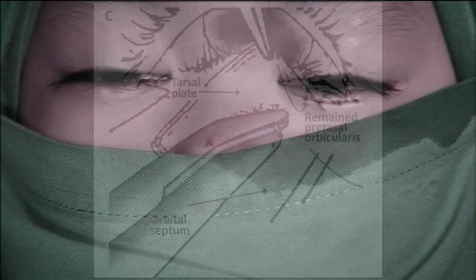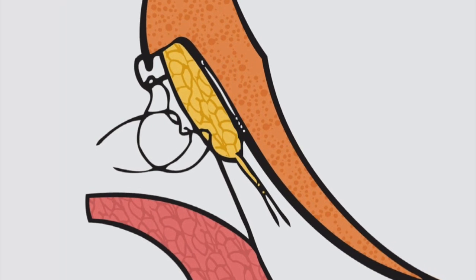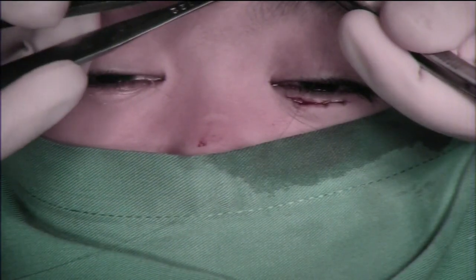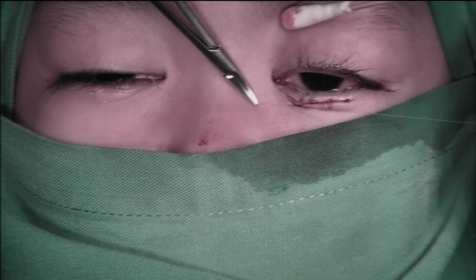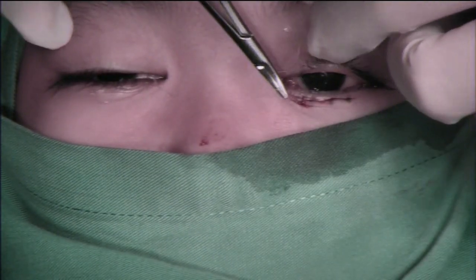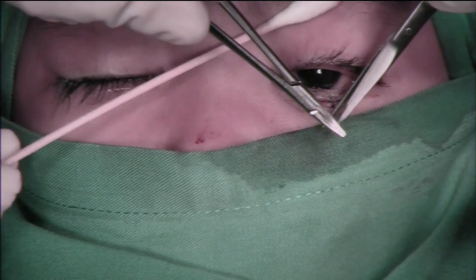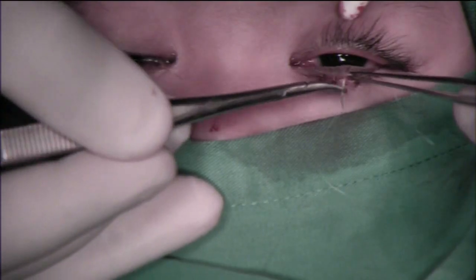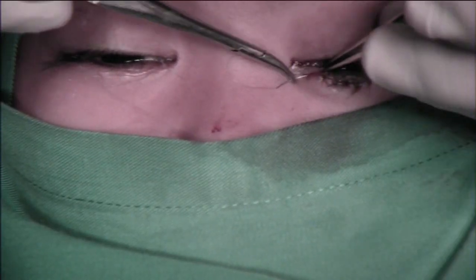Next, suture the skin from the lower end of your incision to the lower tarsal border, to the orbicularis muscle and skin, as close as possible to the lid margin, to pull it outward at a minimum of 3 sutures. The correct suture will automatically pull the lash outward. This video uses 6-0 sterile synthetic absorbable monofilament suture. Additional skin-to-skin suture can be added accordingly.